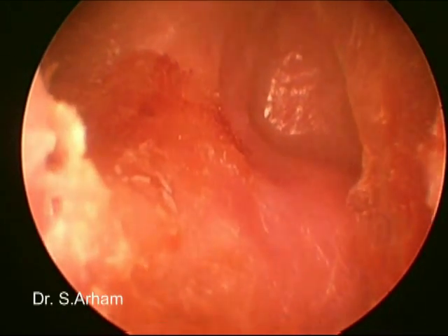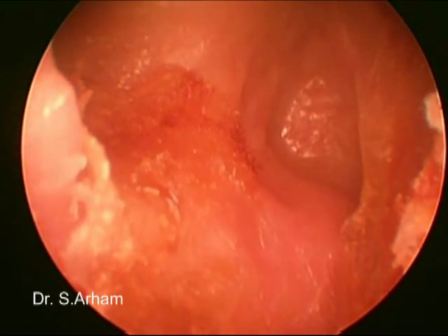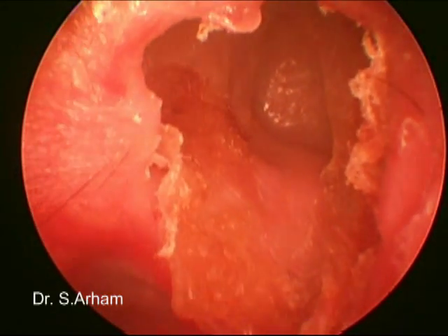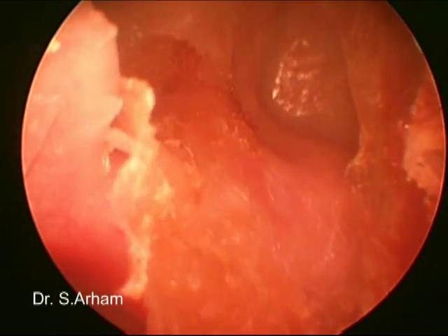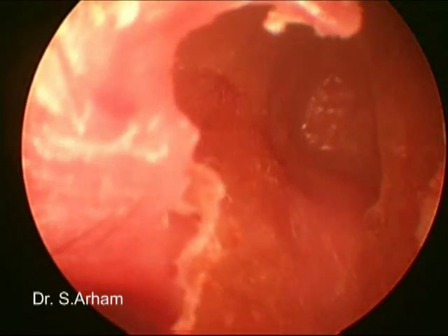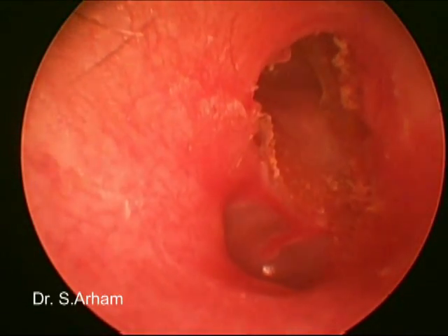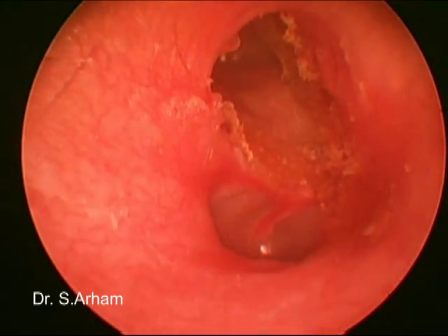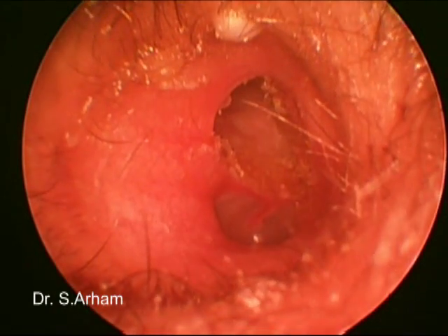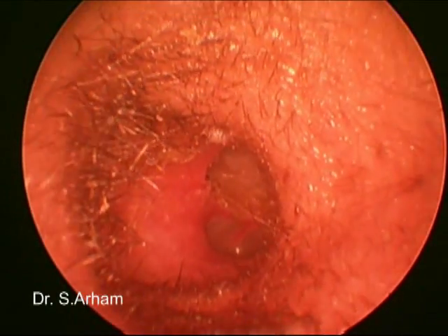This video is recorded nearly six months after the surgery and you can see the nicely epithelialized cavity. The posterior superior canal wall — you can see the opening of this mastoid cavity was made sufficiently large by using big diamond burrs. You can see the disease is limited, located to the attic and the eardrum.